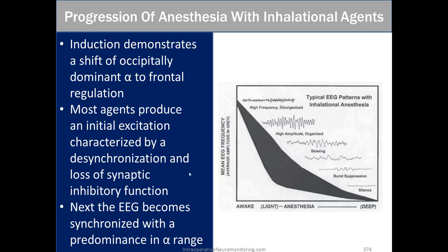Now, in real life, it does not take this nice smooth curve all the way down. We might see the patient awake. We have this fast activity. Put on the propofol, they intubate them, put on some gas. You click it on, and then all of a sudden you're all the way down in burst suppression. So it doesn't have this smooth little transition. It can kind of jump pretty rapidly.